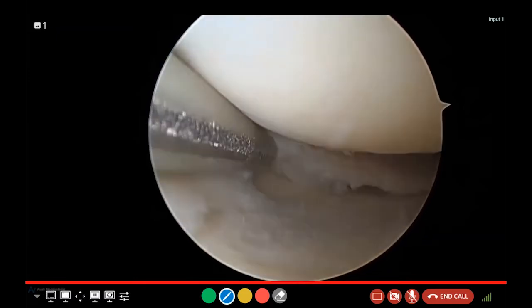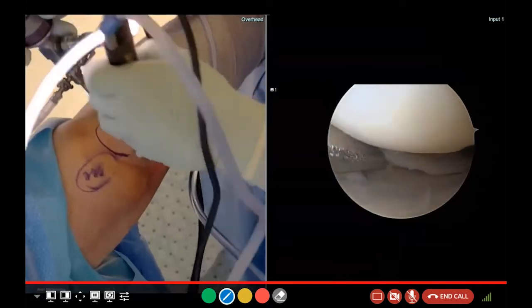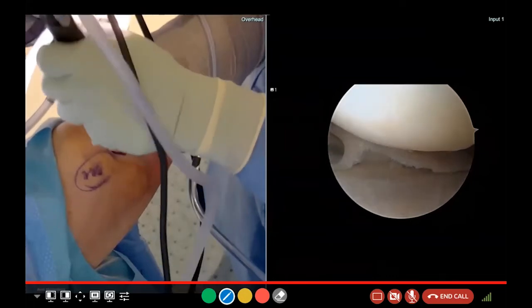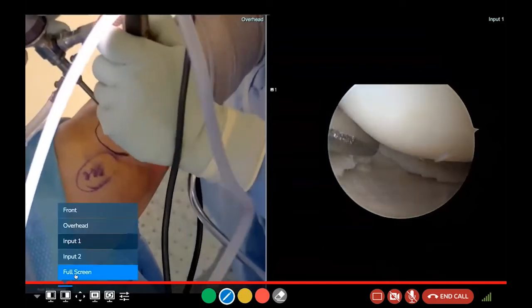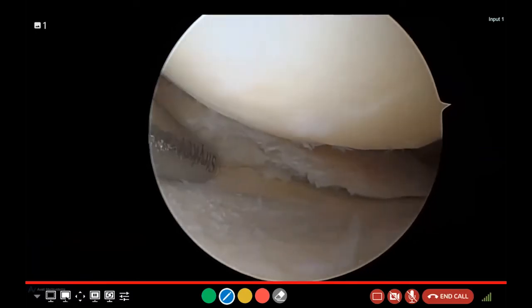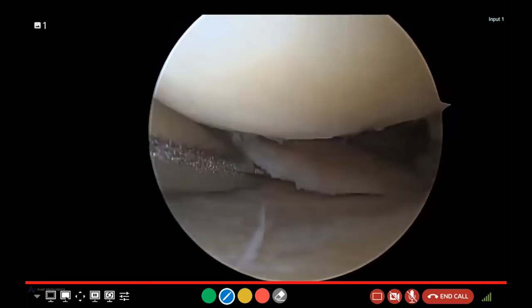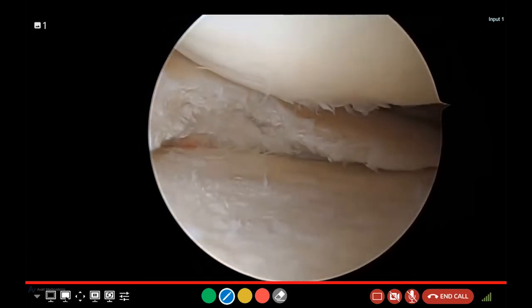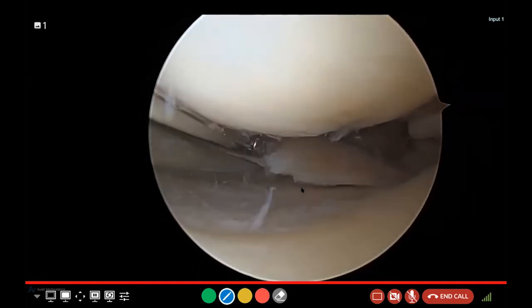That's what Ryan was telling us about — the meniscectomy. So we're going to remove all the portion of this meniscus that's torn. When we get done, what we leave behind will obviously be far less tissue, but nothing will be caught or hanging in the joint that can cause damage. We started with that pretty nasty tear, and now this is a shaver — that's just going to take out all the damaged tissue and make everything smooth again. You can see now it's just missing — that's where meniscectomy comes from, removing the torn part.